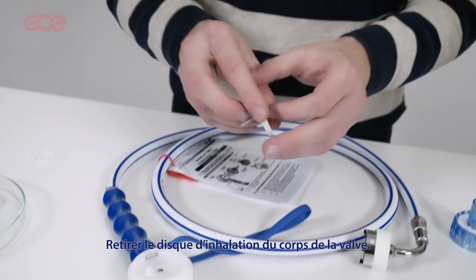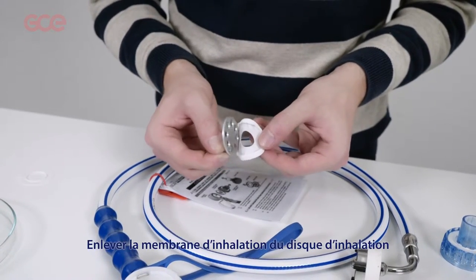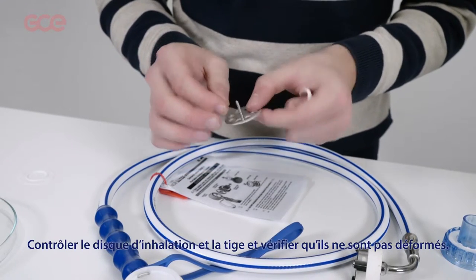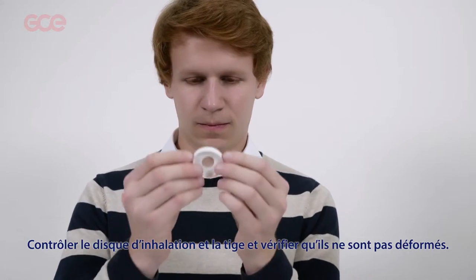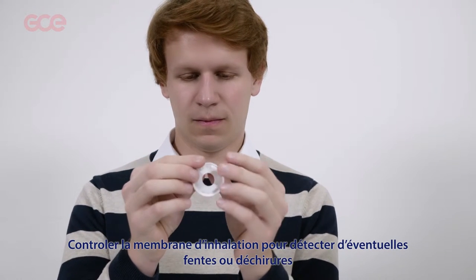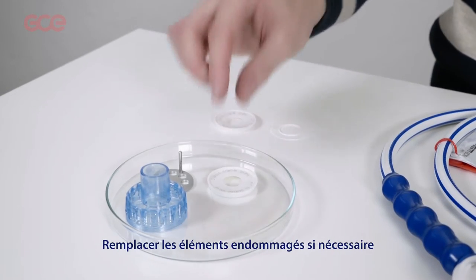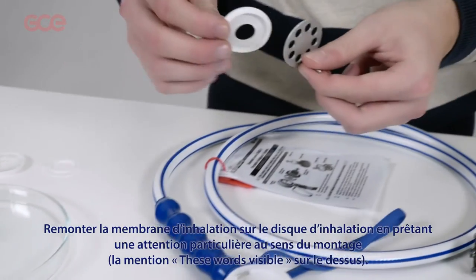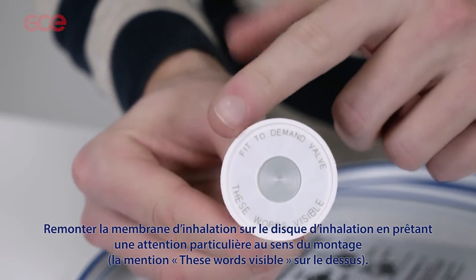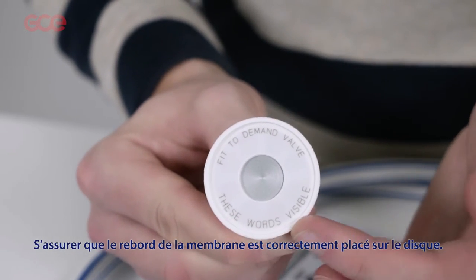Lift the inhale disc assembly out of the demand valve body. Remove the inhale valve flap from the inhale disc. Examine the inhale disc and pin and check they are not bent. Examine the inhale valve flap for tears and splits. Replace damaged parts if required. Refit the inhale valve flap to the inhale disc and make sure it is done in the right way — the word 'visible' should be on the top.